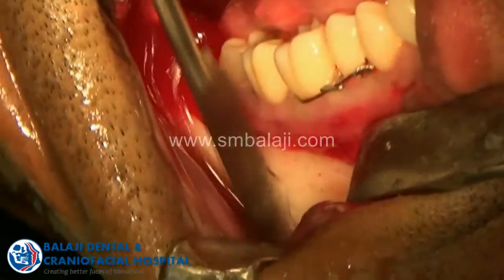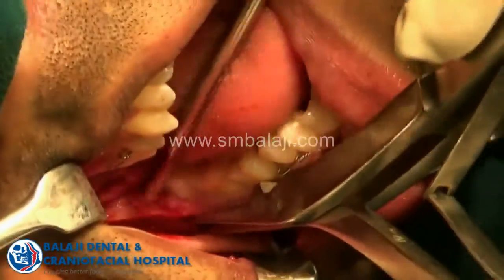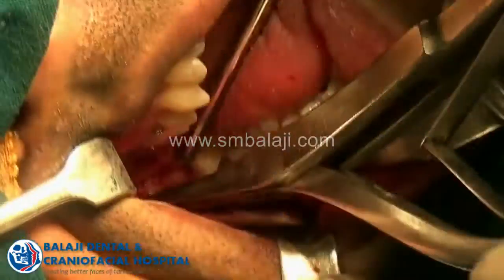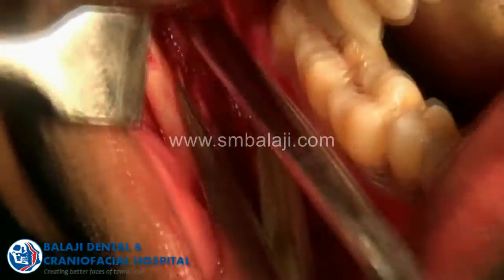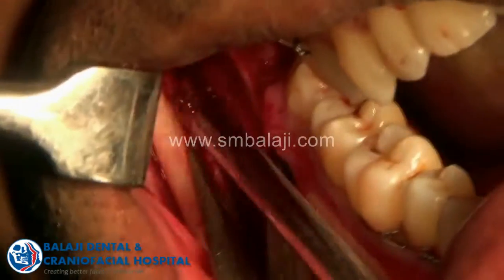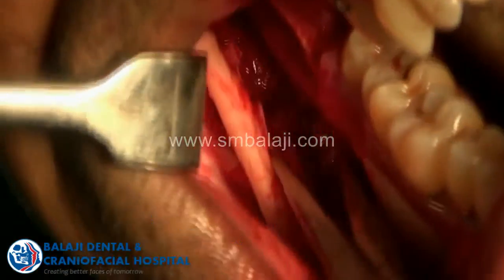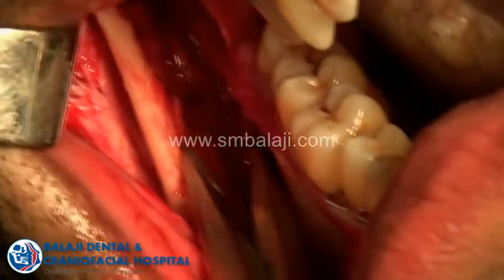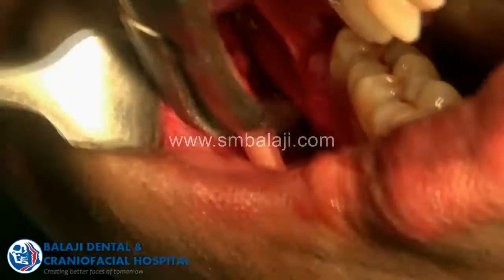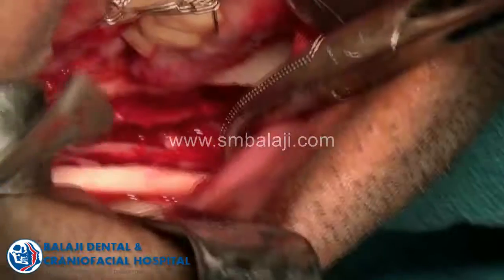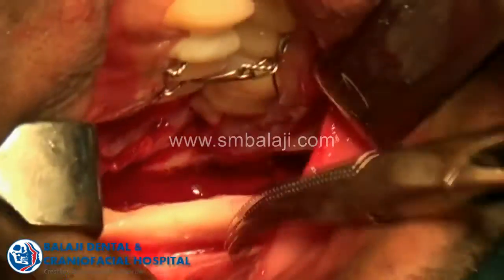After obtaining an initial mild split, you can use the spreader. You can see me using the spreader to split the mandible. Now the mandible is split — you can see the inferior alveolar nerve nicely. The inferior alveolar nerve is with the distal segment fragment, and the proximal fragment is on the other side.